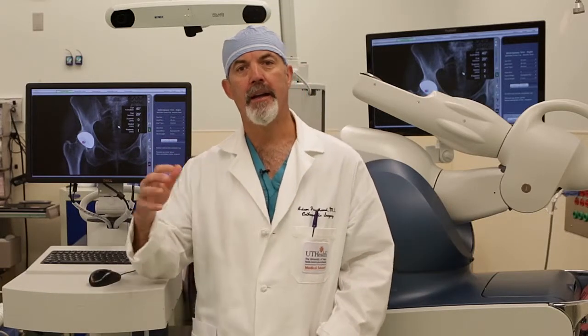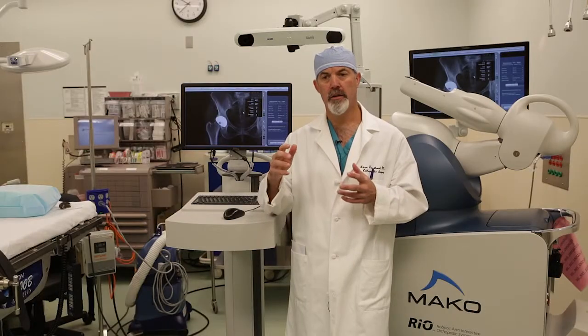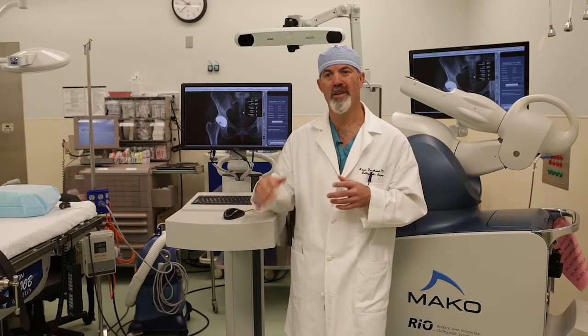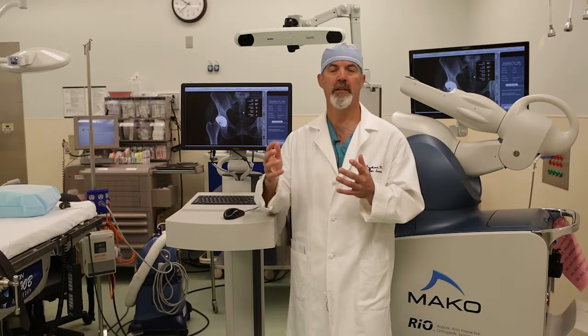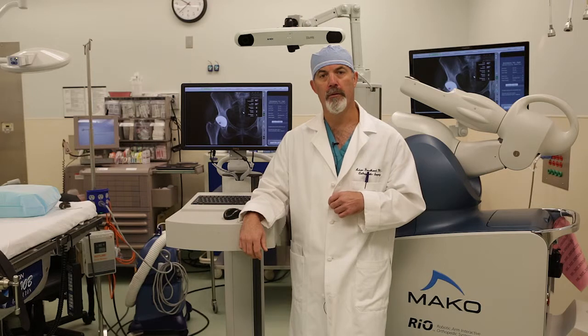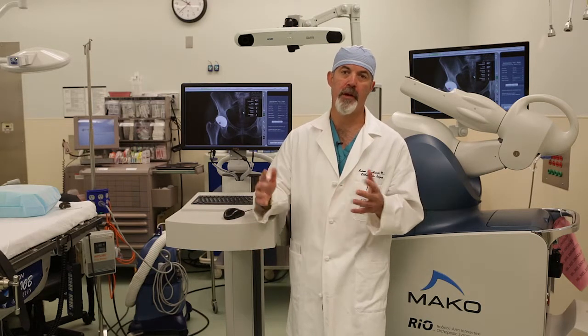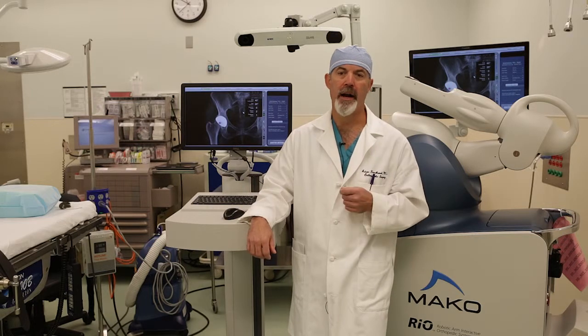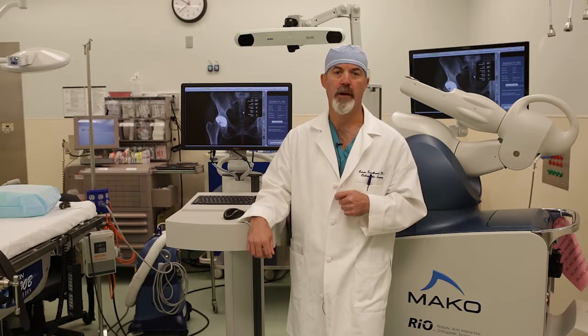So when we look at those partial knee and total hip replacement plans, you'll see the green haptic volume, which is the volume of the implant that you're planning for. And those surgical tools on the robotic side will not work outside of that haptic space or that room that you've selected to ream away bone. And I think that's very important because there are vital structures that surround the bony pieces that you're working on, and with robotic instrumentation, you can't push the robot to get in those soft tissue structures because it just won't work outside of that green volume.